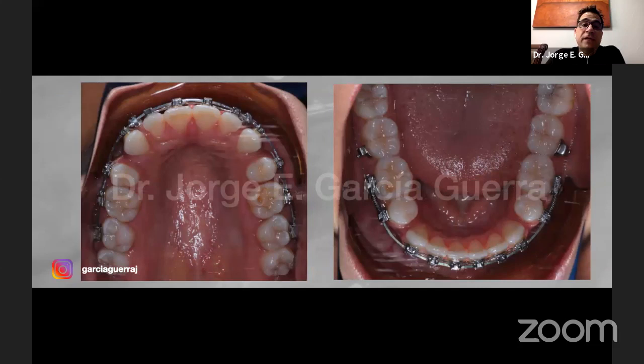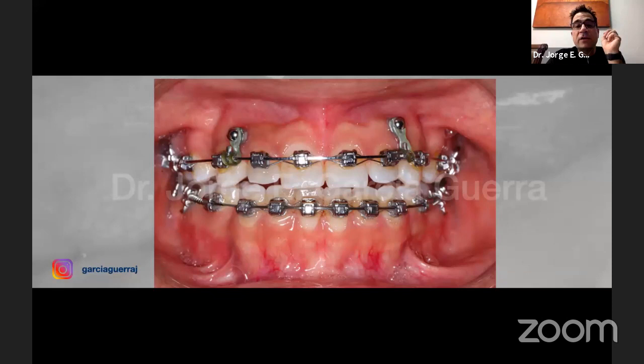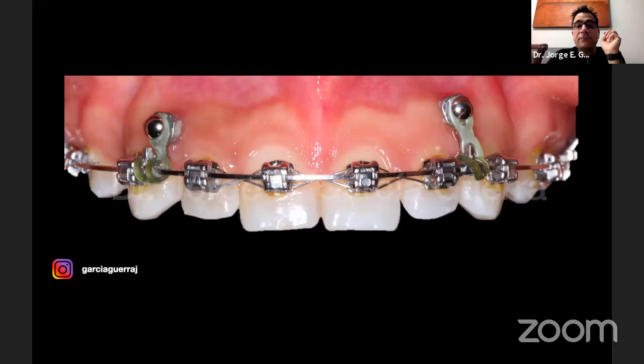And you can see, once we start correcting the overbite, some of the spaces are going to start opening. Now that's something that we expect. So we're going to have better spaces so we can close the spaces and have a better relationship at the end. Now we're going to measure here how the mini implants are. And you can see here we've created a very big open bite. The mini implants are very close now to the arch wire.